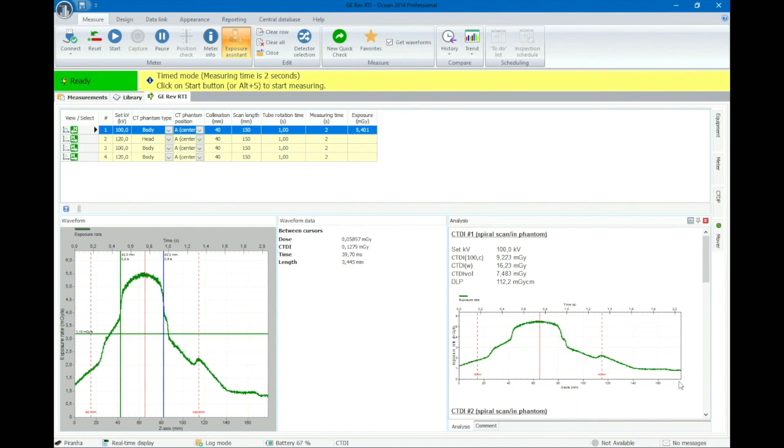You can study a complete view of the dose profile. In the graph you can see two red lines. The dose between them is the CT DI 100.